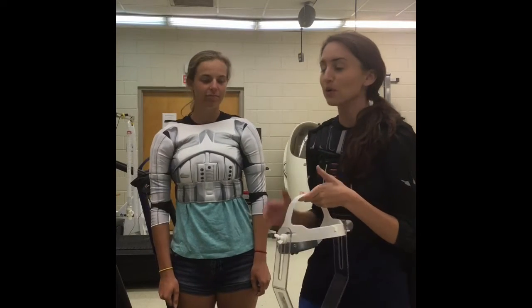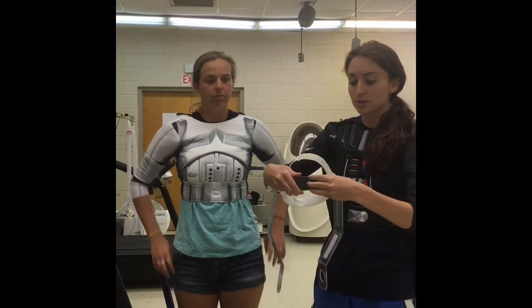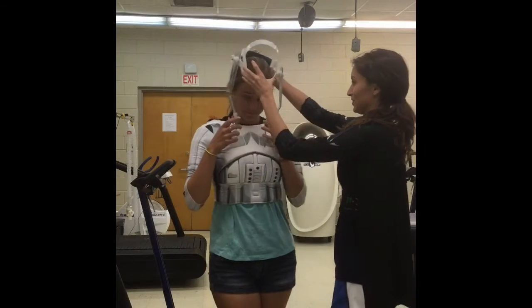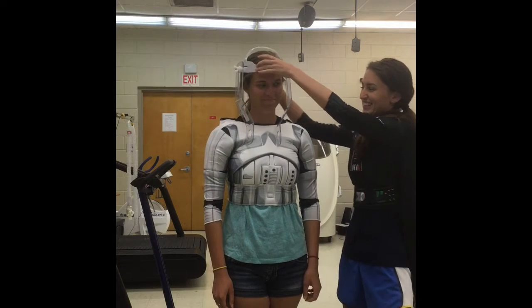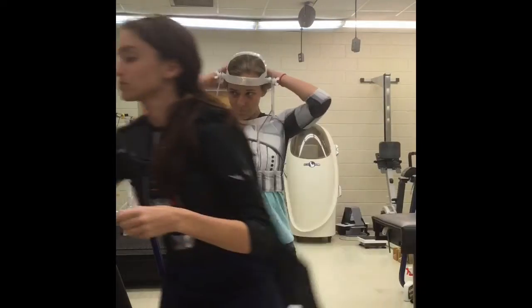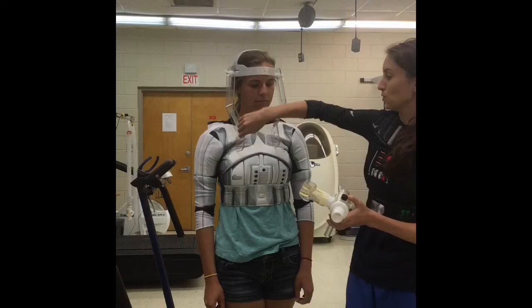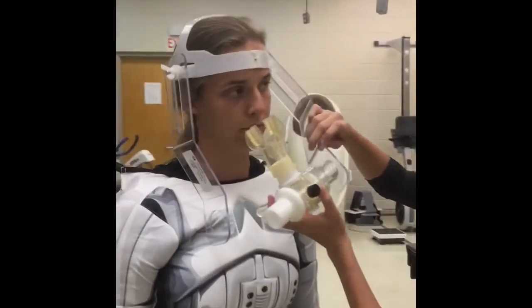Next we need to put the headpiece on the participant. On the back there is a spin wheel that adjusts the tightness around the forehead area while they place it on their head. Make sure it is nice and snug so it won't move. Then take the mouthpiece assembled earlier in the video and thread it through the little holes on the sides of the headpiece.